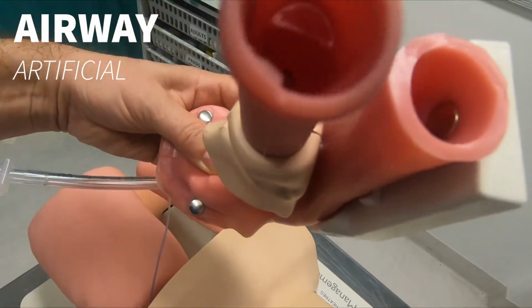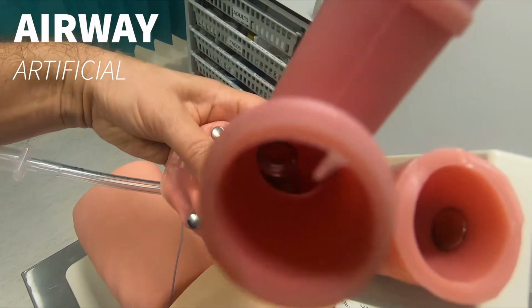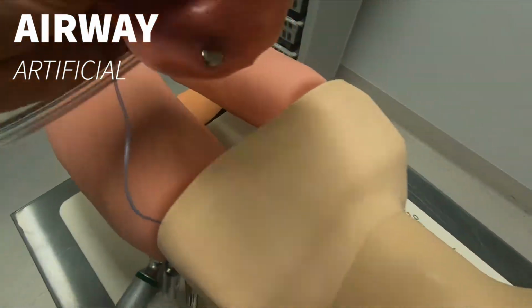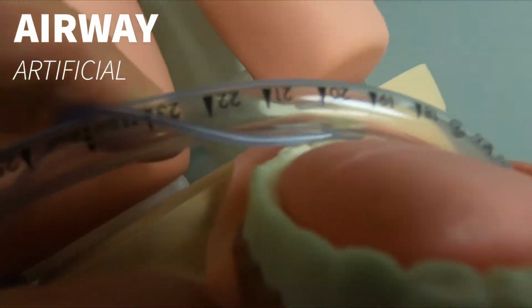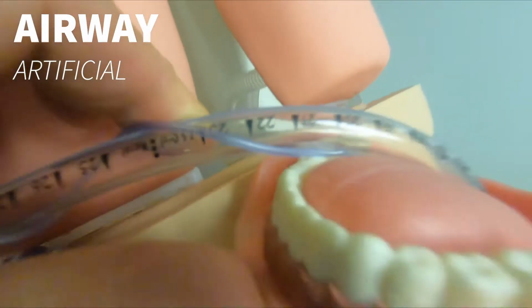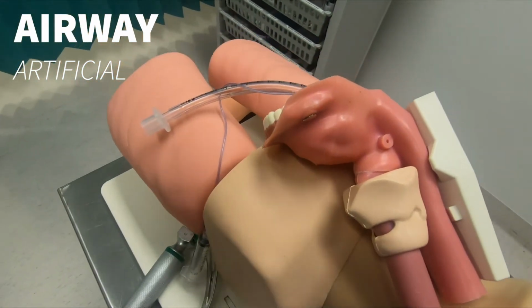So now it's better, it's no longer in the right bronchus. I can see it in the depth, just there. And now at the lips, it is 22, 23. Yeah, and that's a good depth. And that's your ET tube.